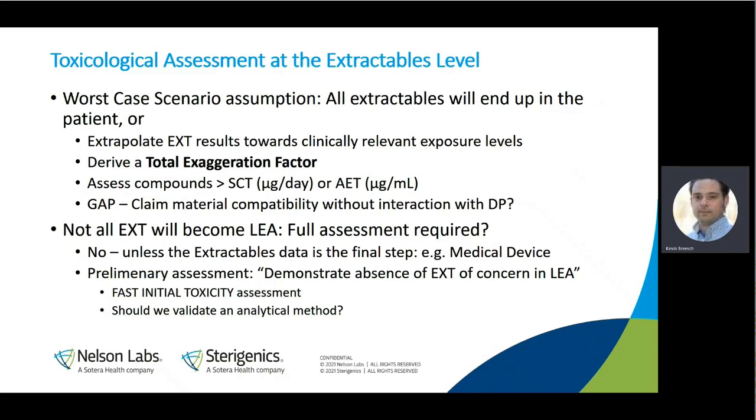Not all extractables, luckily, will become leachable. So are we doing already a full safety assessment on all extractables? I would say no. Sometimes we have more than 100, up to 200 extractables identified. It would be very time consuming and costly to do this. And not every extractable will become leachable, so you will be doing some unnecessary work.